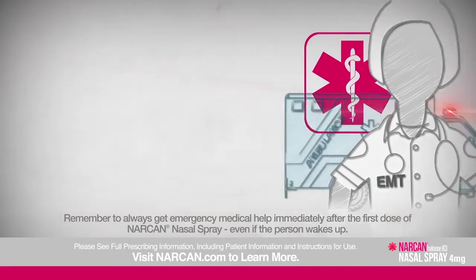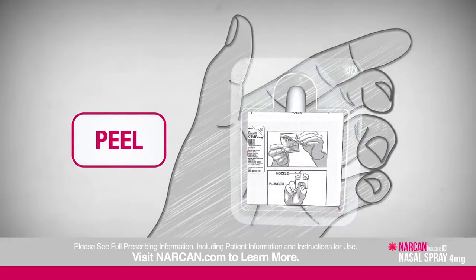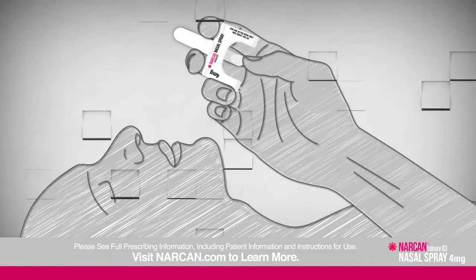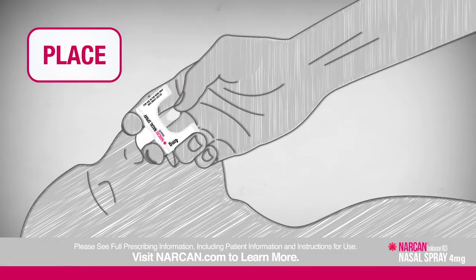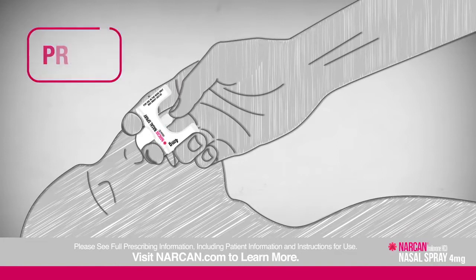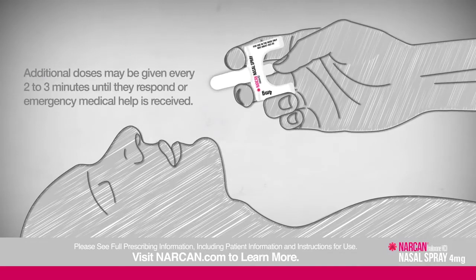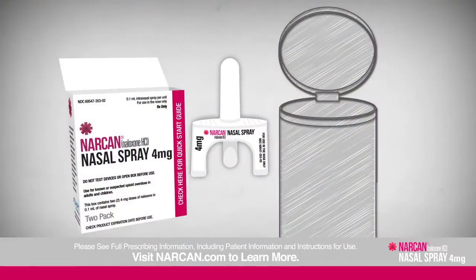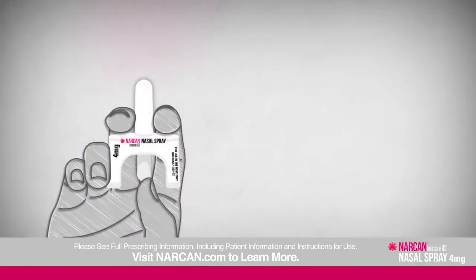Keep the person under observation. If the person doesn't respond by waking up or breathing normally after two to three minutes, administer the second dose provided in the box in the alternate nostril. If they respond but signs of an opioid emergency return, give another dose in the alternate nostril using a new device and watch them closely until emergency help arrives. Additional doses may be given every two to three minutes until they respond. After using Narcan, dispose of the device safely away from children.